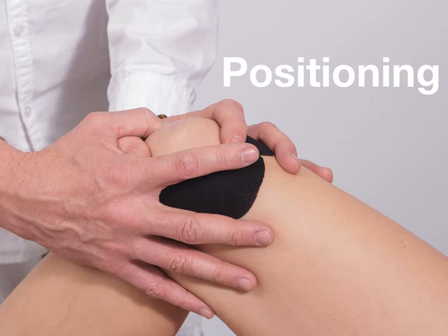For example, when evaluating the knee for a patellar tendon disruption, it's important to have the knee flexed with the hand held under the knee and visually watch the patellar tendon move as the knee is attempted to be extended. This will allow you to visualize if it's a complete tear or a partial tear, as well as to assess for swelling of the tendon.